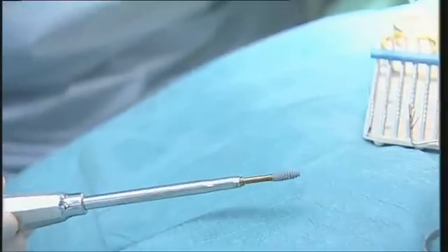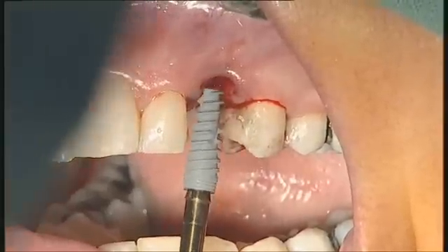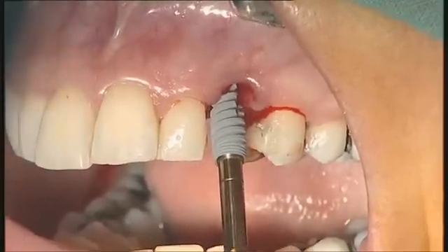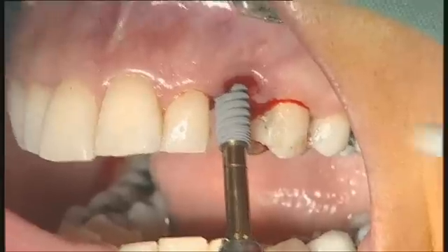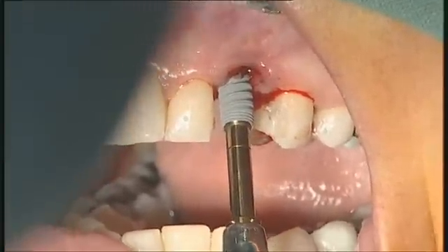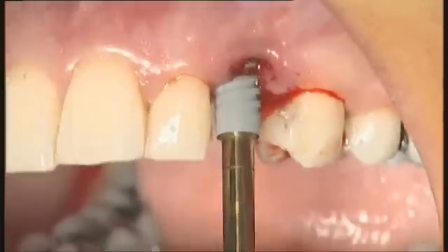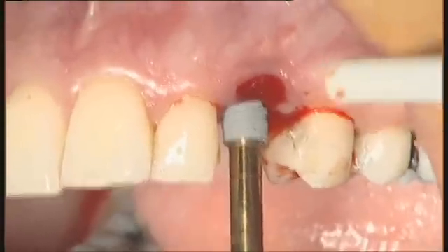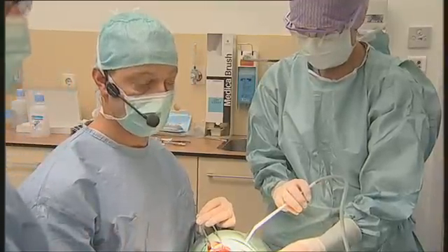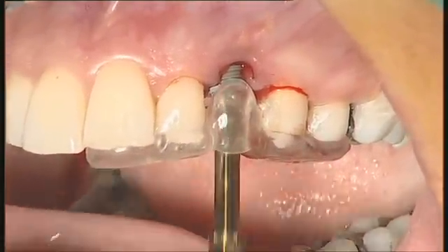I'm going to place a 13 mm long implant, bringing it on the hand screwdriver. I will first slightly enter the implant into the palatal wall, then slowly change the direction and go deeper. This is the right direction now. We will check the orientation with the surgical guide — the direction is okay.